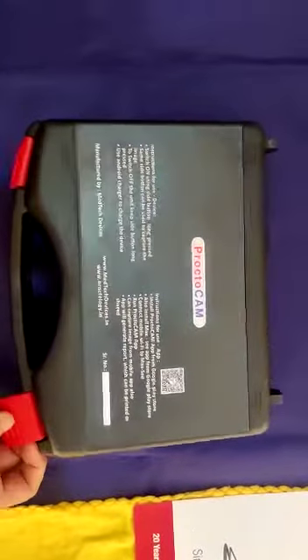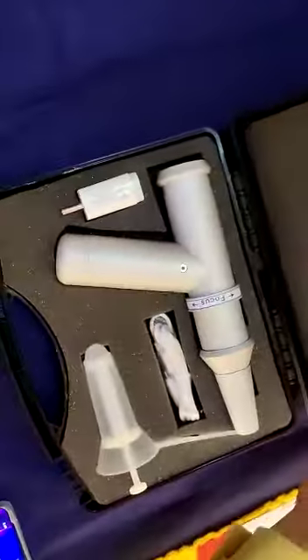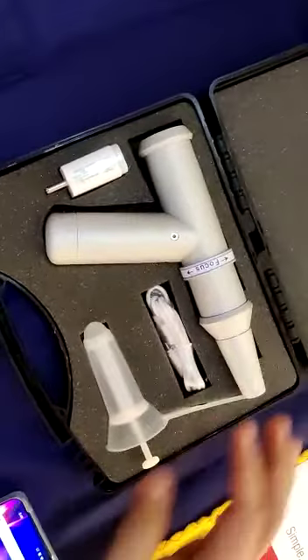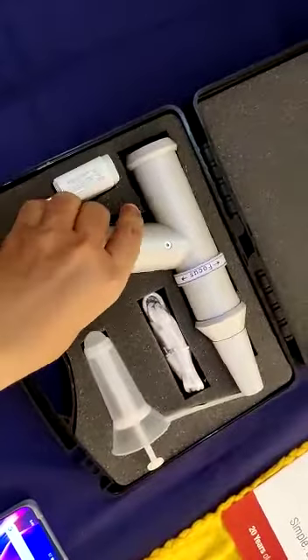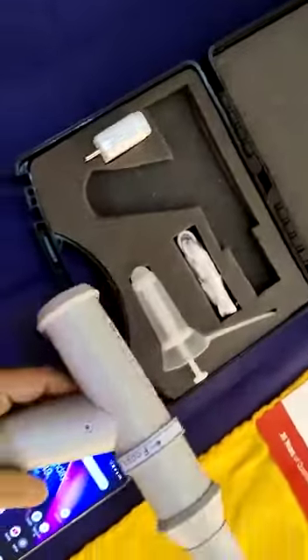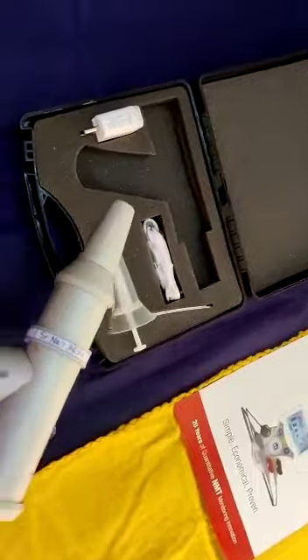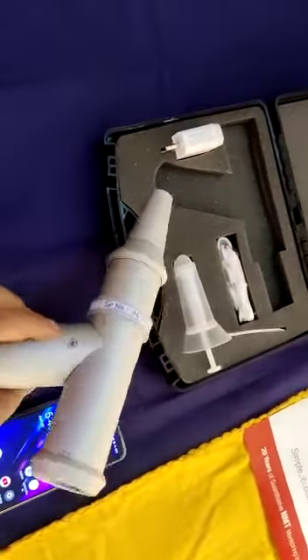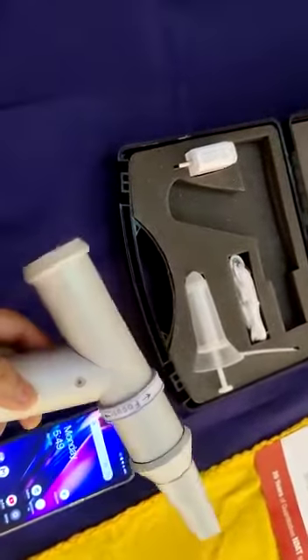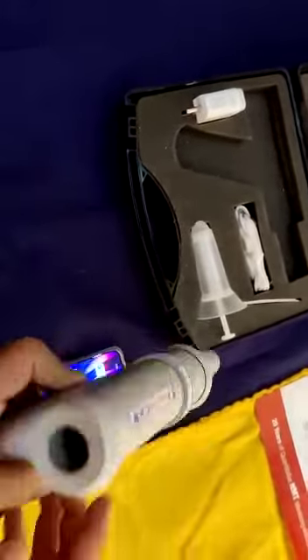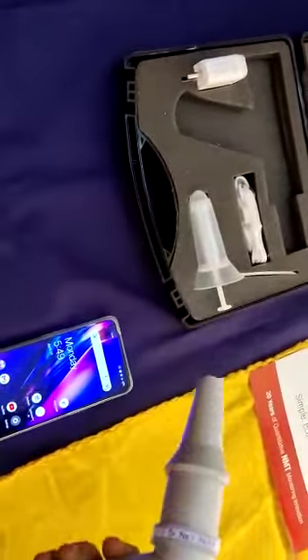ProptoCam video, ProptoCam scope camera from Medtech Devices. A very easy and convenient device to monitor and visualize the anal inside position.